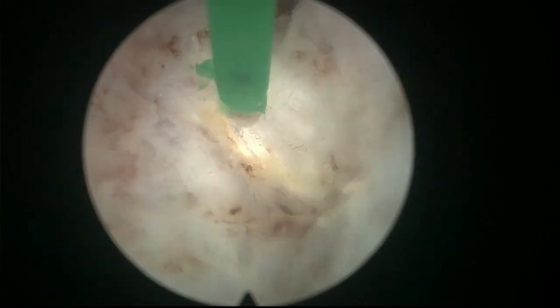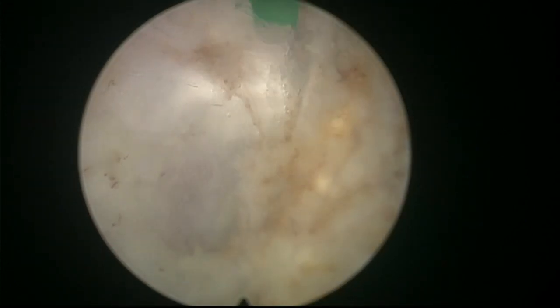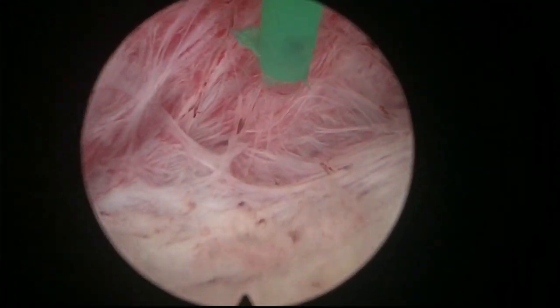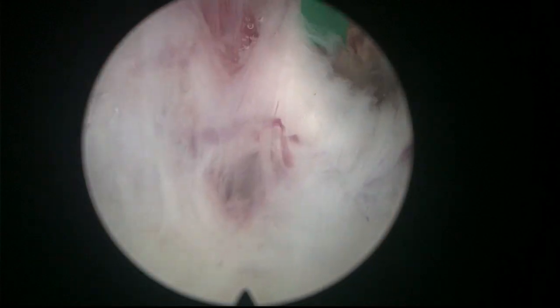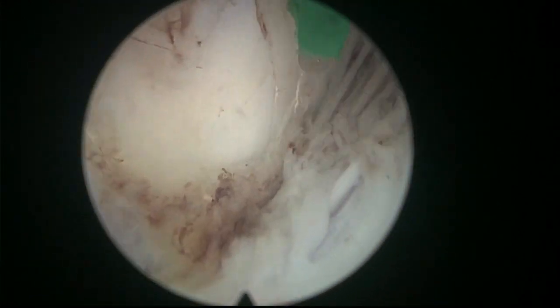The plane was changing direction, going up towards the bladder neck. Remember, we didn't enter the bladder in this patient before the operation because the adenoma was quite large and there was a middle lobe, so we had to push the endoscope down too much. So I decided to start the procedure.